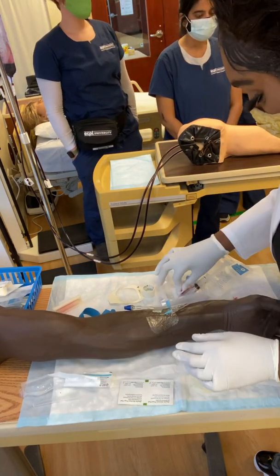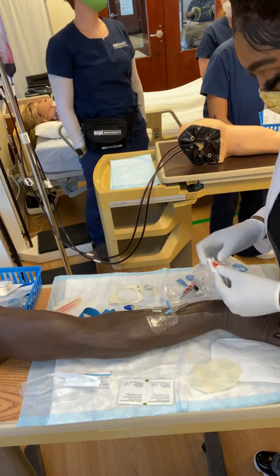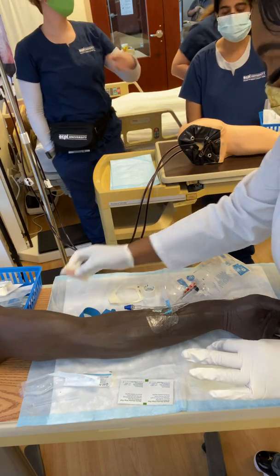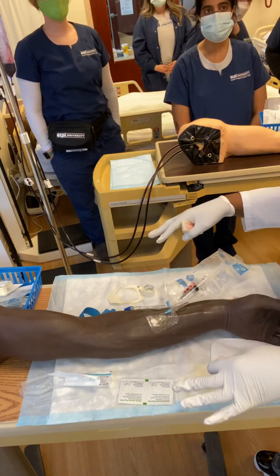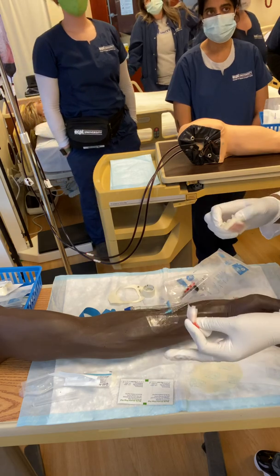Let's get cracking. Oh, you know what? I gotta do my removal. Let's remove. All right, so easy with the removal. All I do with the removal is, you know how you get there and there's so much tape, and then the skin is frail, like, oh my goodness, it hurts.